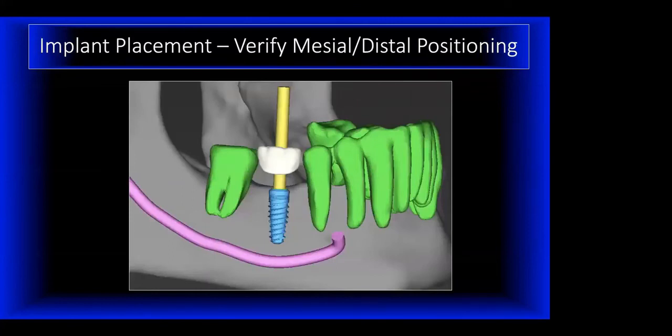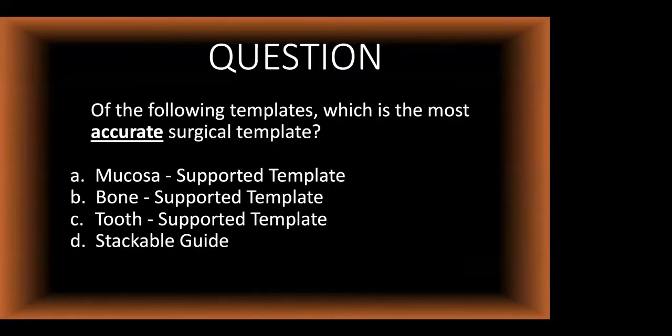So as I said, there are sometimes issues with the second molar when you're replacing the first molar with the mesial-distal positioning. When you have a distally inclined second molar like this one, you don't go parallel just to the second bicuspid. You bisect the angle of the long axes of the second bicuspid and the second molar. So you can see that is more of a proper position. And that is basically the only tooth in the mouth that has that issue, mainly because of the very common distal inclination of that second molar.